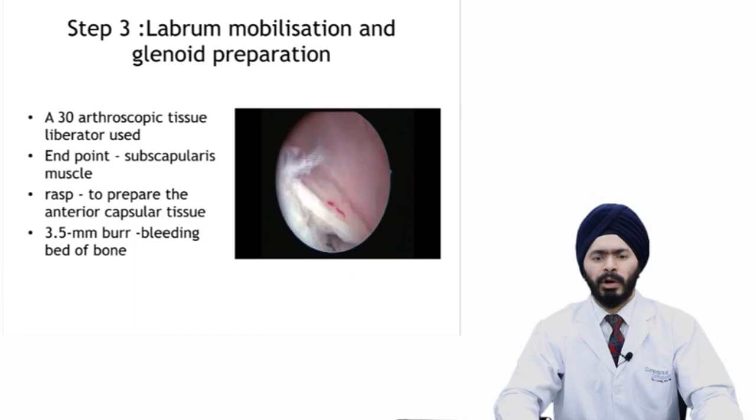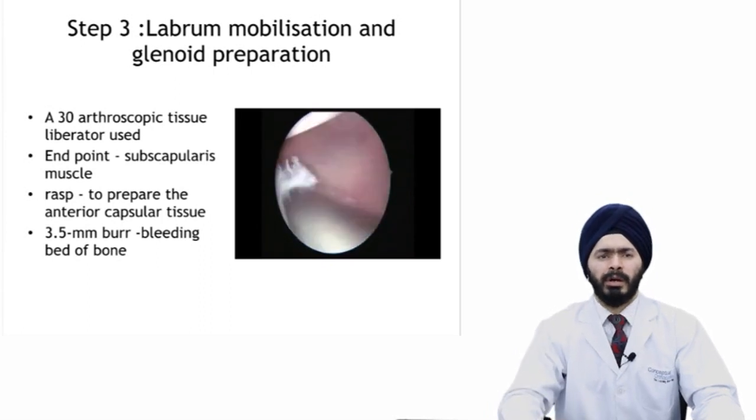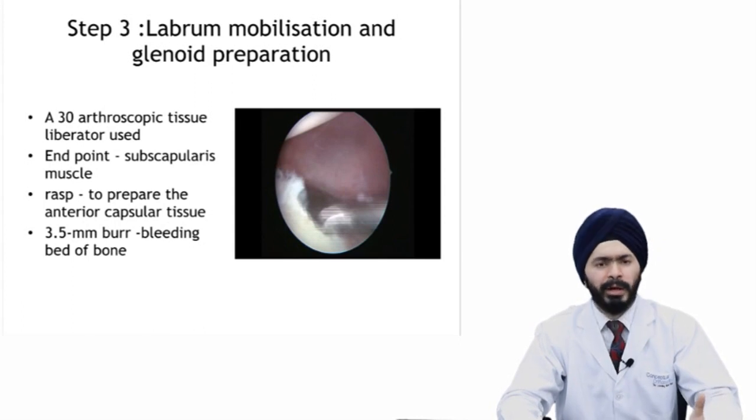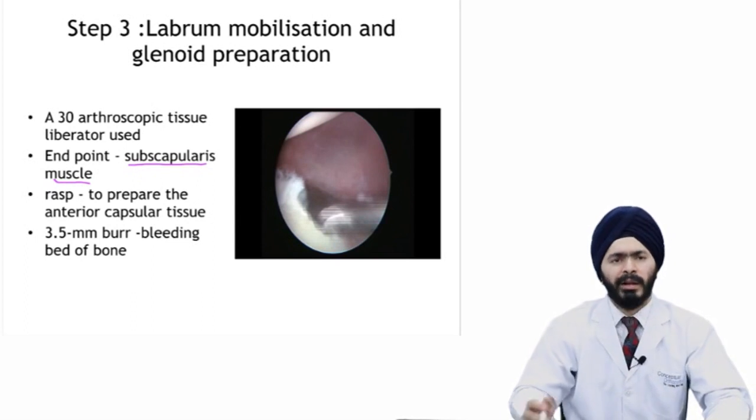I go up to six o'clock or beyond six o'clock to liberate the labrum thoroughly, so that the liberated labrum can be easily pulled back to the glenoid surface and reunites in the normal position. How do I know that I have liberated the labrum well? You will be able to see the subscapularis muscle — the red muscle — between the labrum and the glenoid neck. That is the endpoint of liberation: you should be able to see your subscapularis muscle after liberating your labrum.